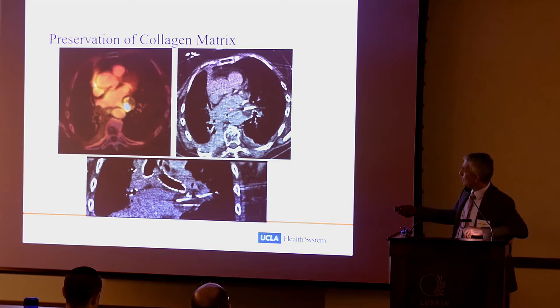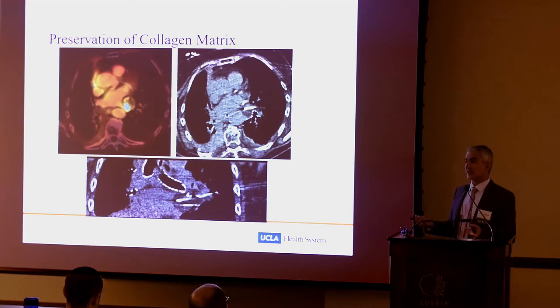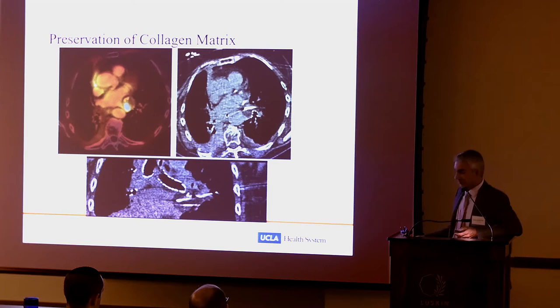Look at the ice ball really growing, carving out the left atrium, and then you can see it being carved out by the bronchus. Again here, the ice ball engulfs the bronchus very nicely, but the bronchus doesn't get damaged. That's the advantage of cartilage. This was the only case we've done under general anesthesia. All our cases we do under local, but we just didn't want her to move around when we were doing this procedure.